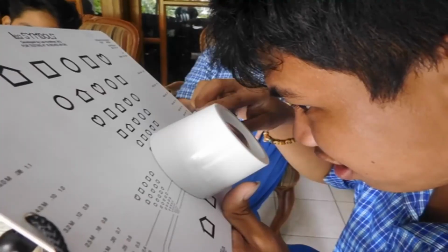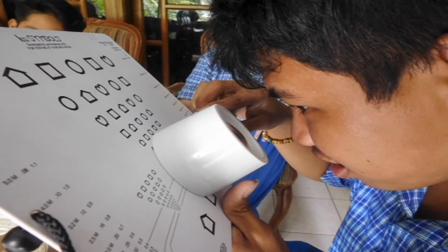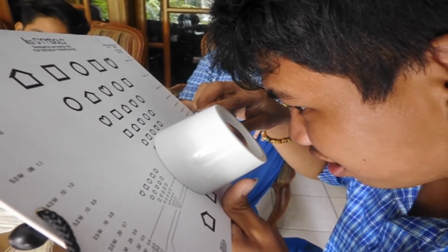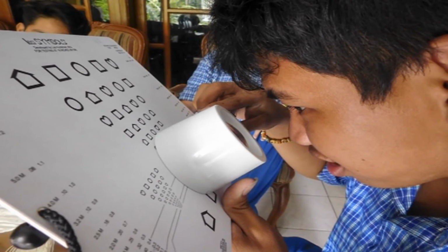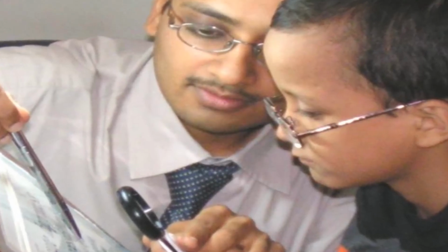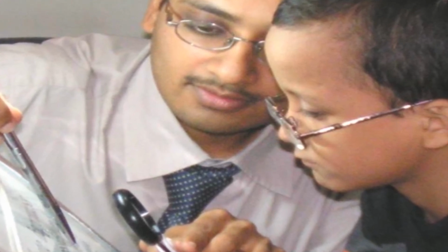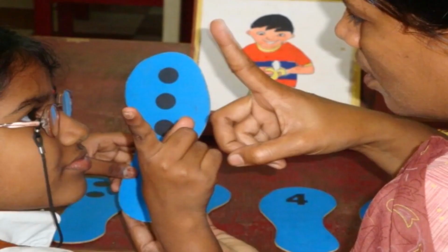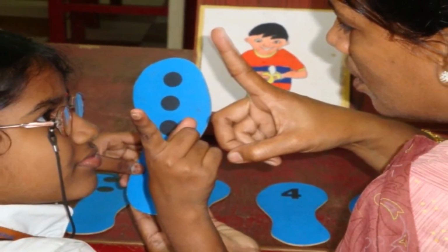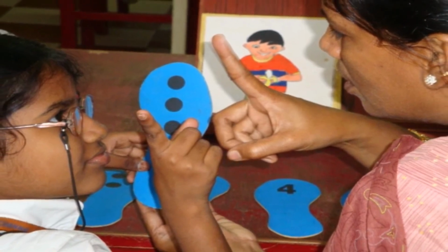The children accept the low vision devices more readily than adults and with a higher rate of success. They tend to use more than one device depending on their requirements. Good communication with parents and teachers is important in order to maximize the successful use of low vision devices. Parents and teachers should be encouraged to note difficulties when using low vision devices, especially during the first home trial.